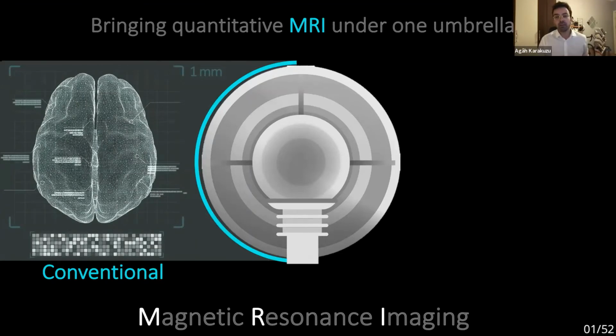Conventional MR images portray the scanned body part using shades of gray, and their contrast doesn't target a certain substance, but it is determined by the complex makeup of the tissue. Years-long clinical expertise is required to make a diagnosis by looking at these images. In radiology reports, we see statements such as normal appearance or a hyperintense region, which is sometimes followed by a question mark if the contrast doesn't help specify the abnormality. This shows that even the expert readings are subjective because the conventional MRI is qualitative.